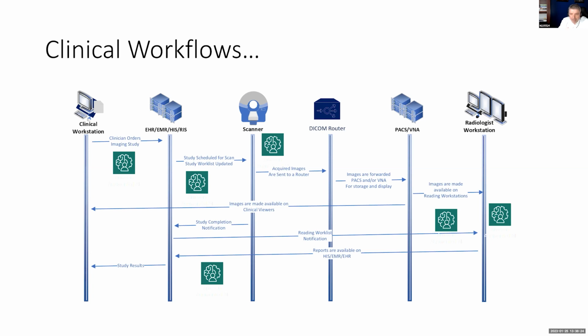What we'll be covering is in between the scanner on this diagram and what goes into a radiologist workstation. That's more aids, like let's say you do a segmentation algorithm, or an image detection and classification algorithm, that's where those are happening.